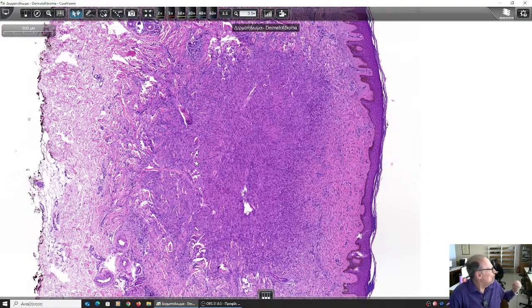So in terms of terminology, how would we term a benign neoplasm coming from fibrous tissue, from fibroblasts? How would you say that? How would you diagnose this neoplasm? What do you think? We can come this way now. Here we are. It's a fibroma. So this is a dermatofibroma. That's all. It's well excised. It might not be neoplastic.